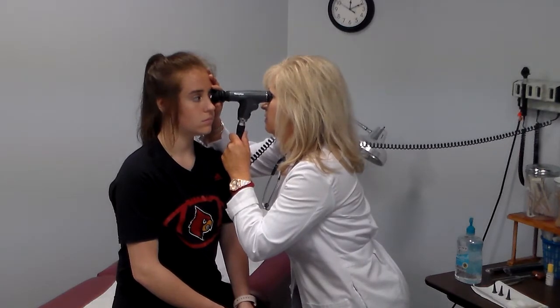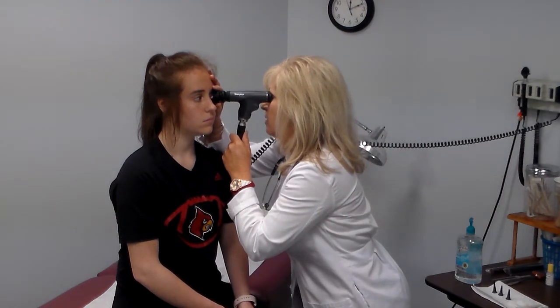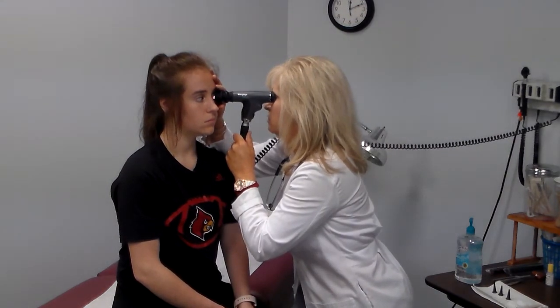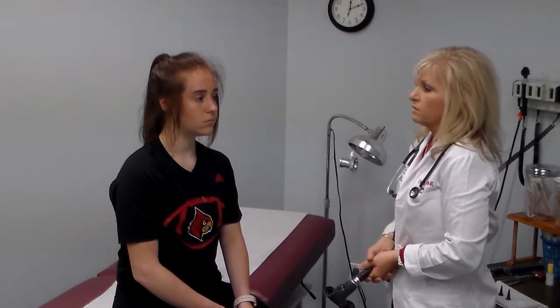Okay, I can visualize the optic disc, the retina, and the blood vessels. Make sure that you tell the SP that you're observing the retina, blood vessels, and the optic disc during your clinical examination.